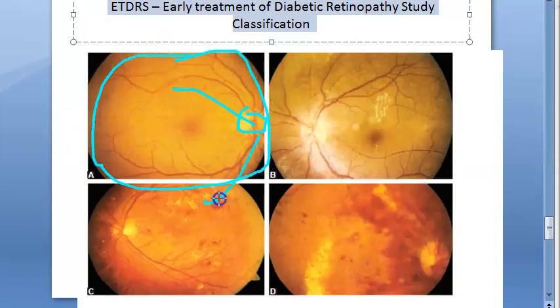You can see the retinal arteries, veins, etc. here. You can see the macula. You can see the fovea. So basically this is the right eye. Anyways, one is left, one is right and all that. But this is the right one. You can understand that, right?